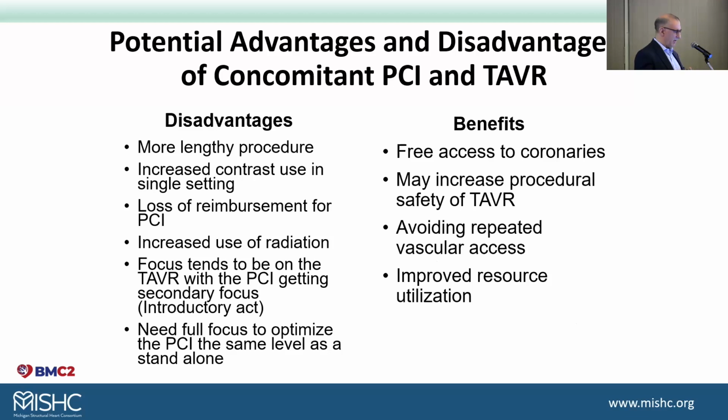Concomitant PCI and TAVR, disadvantages: when I have 4 or 5 TAVRs in one day and I'm bouncing from room to room, if you add even 5 extra minutes to the case, it sets a domino effect in motion that kills me and kills the whole team. So it's a more lengthy procedure. There's increased use of contrast in a single setting. This is very important. Maybe it shouldn't be to us, but it's the reality of what we live in. Hittinder would come back and ask me why we're doing this.